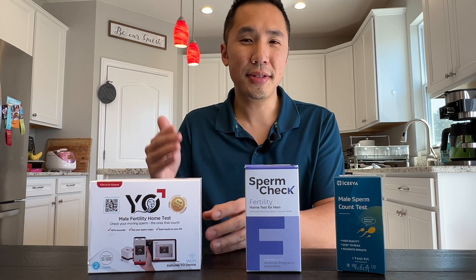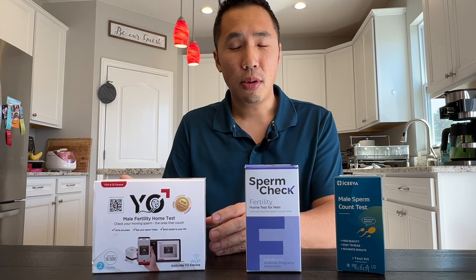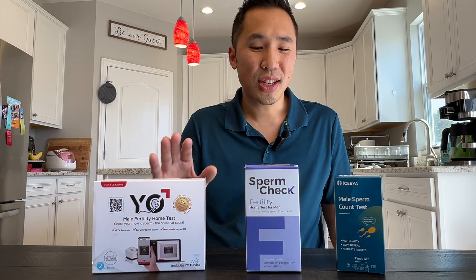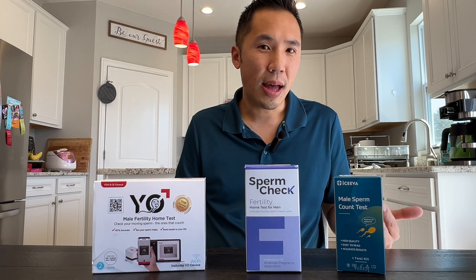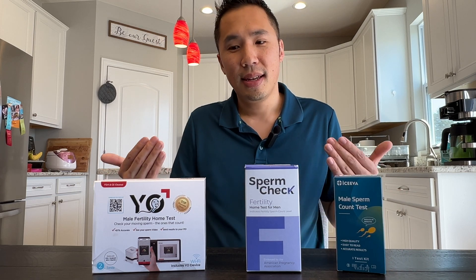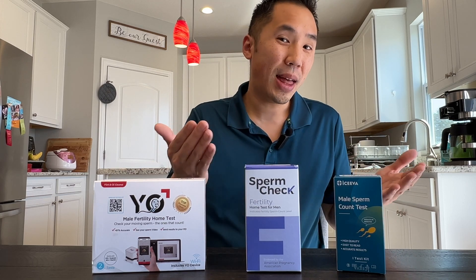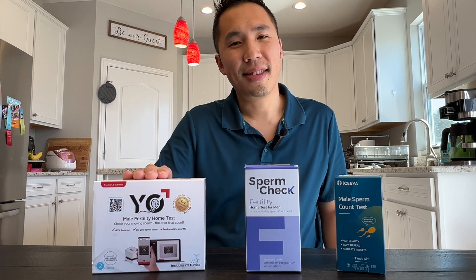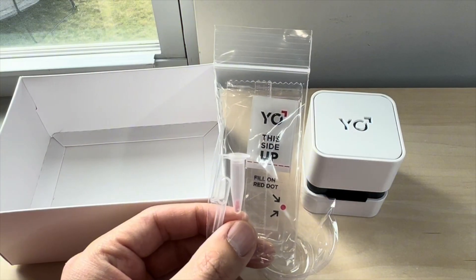Finally, there's the Yo male fertility test. This actually provides you with a test result which is a video of your actual swimmers. It measures the motility of your swimmers and not just the count of your sperm. Motility, in my eyes, is a much more important metric because those are actual sperm that are swimming and moving, versus sperm that may be dead or not moving at all. I also like the fact that this comes with two kits, so there's room for potential human error and you can try again.